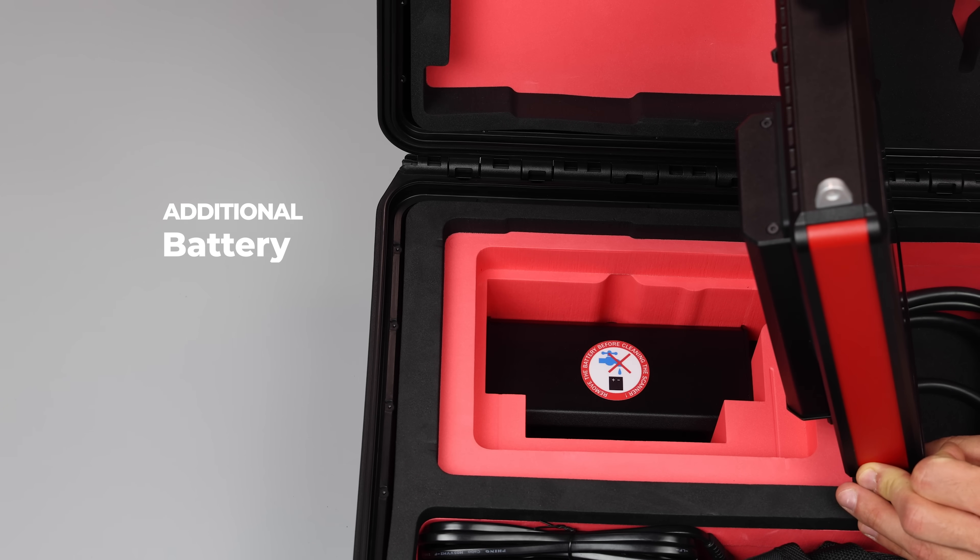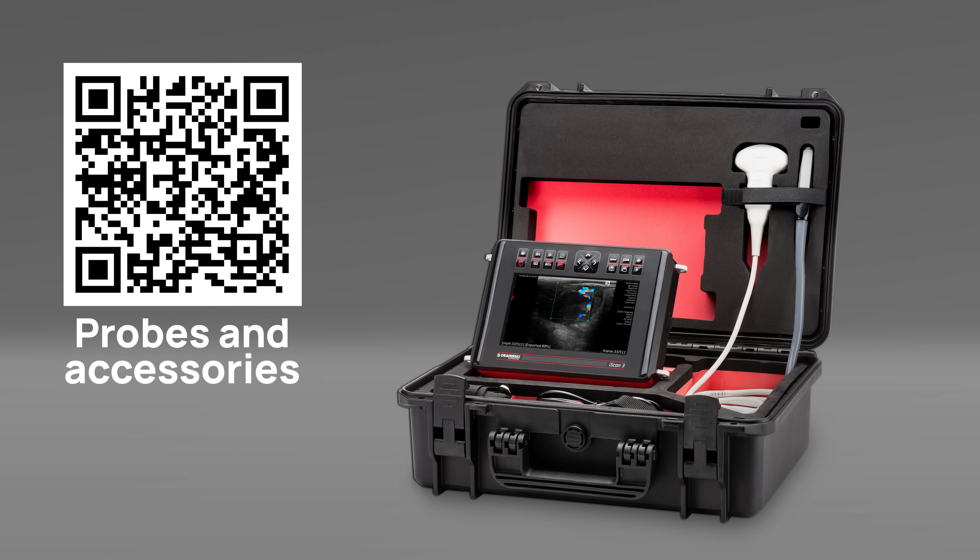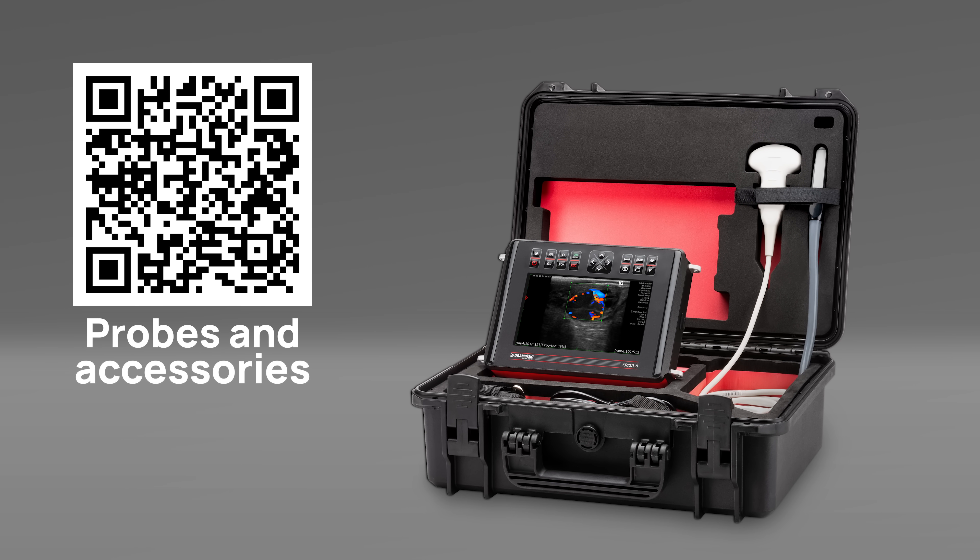There is also a place in the case for an additional battery. Scan the QR code and learn more about the available probes and accessories compatible with the iScan3.